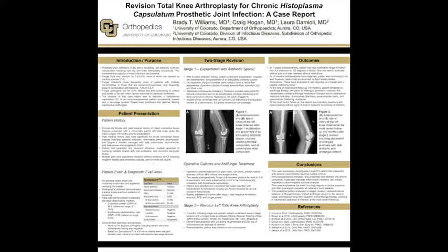Following a 6-week antibiotic holiday, the patient underwent stage 1, including explantation, antibiotic spacer, and placement of temporary components. X-rays in Figure 1 demonstrate anteroposterior and lateral views of the left knee obtained after explantation and placement of the articulating antibiotic spacer and temporary components. Cultures including synovium, synovial fluid, and tibial bone were all followed postoperatively. At 2 weeks postoperatively, 3 of 4 cultures were found to be positive for mold and were subsequently speciated to be morphologically consistent with Histoplasma.